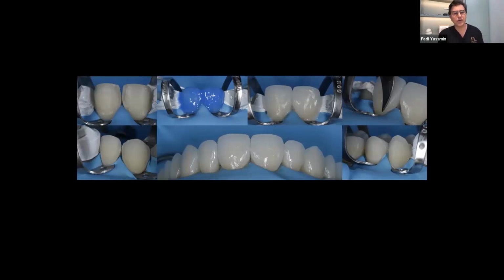So with the milling protocols, remember, and this is probably a bit of a hard concept to understand, a lot of these cases, the digital wax-up comes from true natural files. They're actual HD copies of real teeth. So there's a whole library database of beautiful teeth. And the beauty of digital is you can copy and paste for each design what is the ideal shape.